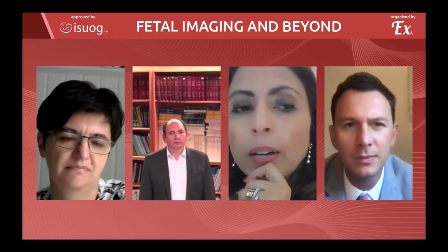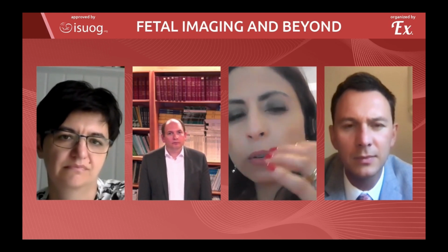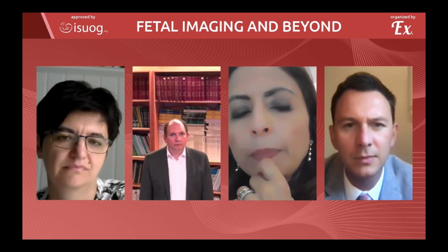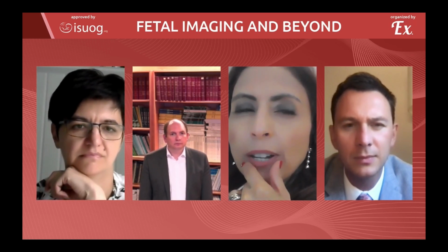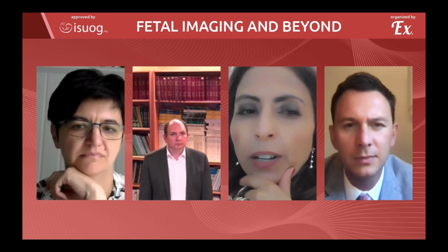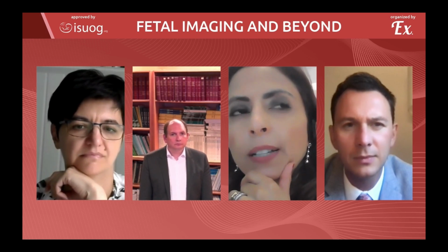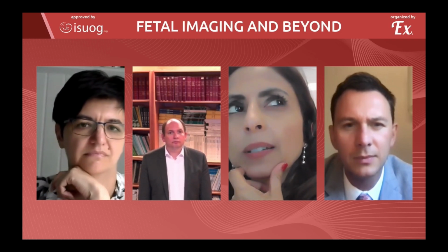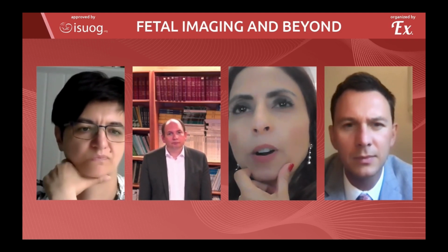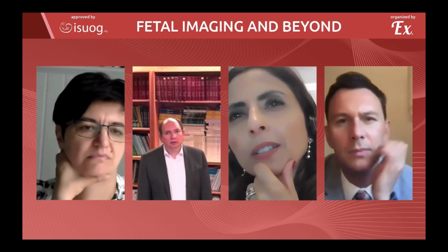There were some minor changes in the temporal lobe with hyperechogenicity, but there were no cysts. The baby was delivered, I think, about 2 weeks later, and the postnatal cranial ultrasound identified cysts in the brain. Do you think that's a false negative result on the MRI, or can it not be a false positive result on the postnatal imaging?